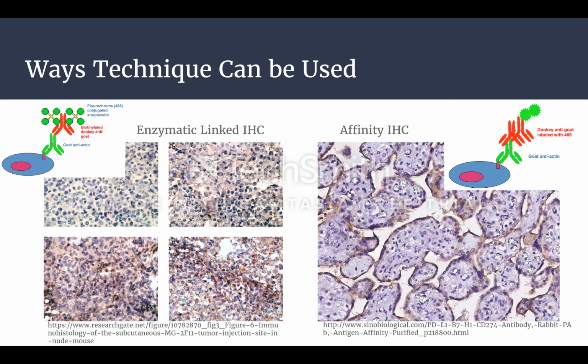This method has many advantages because a fluorescent microscope does not have to be used, and the stained samples can last a very long time. There are two procedural techniques that can be used when performing the enzymatic method, and they are simply defined as direct, which is a one-step procedure method, and indirect, which is a two-step procedure method. But both procedure methods will acquire the same general results.